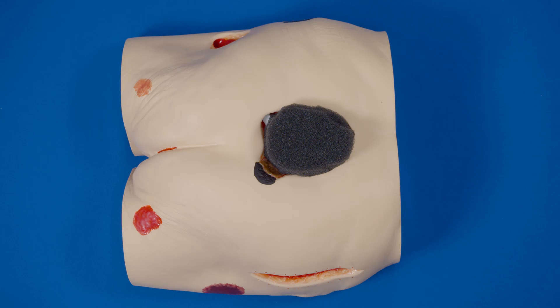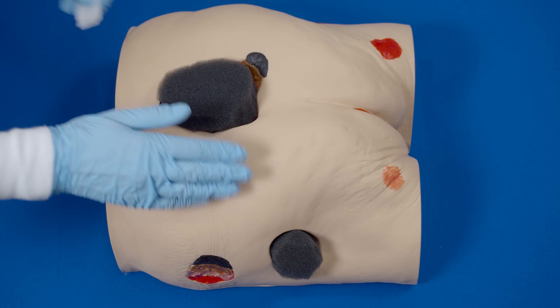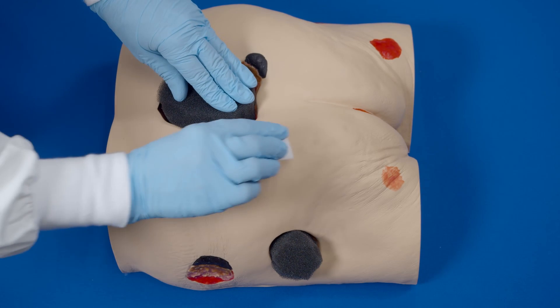Place the black foam into the wound cavity. Do not tightly pack or force foam into the areas of the wound. Do not allow the foam to overlap onto intact skin. If utilizing white foam, ensure white foam is in contact with black foam — foam touches foam.